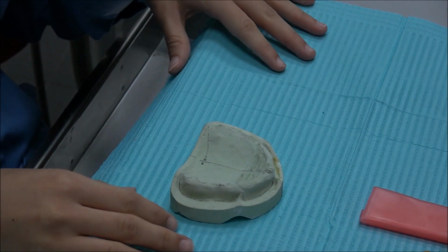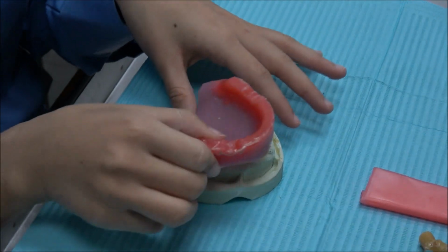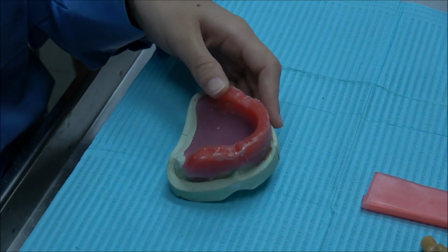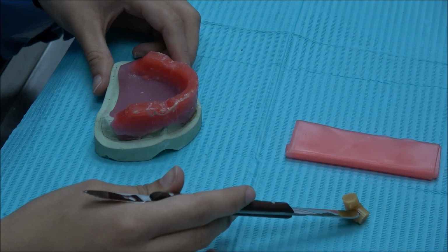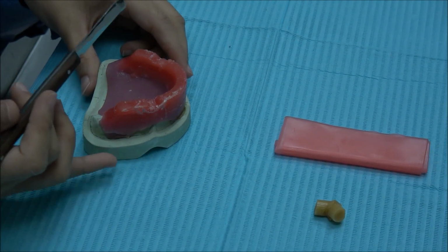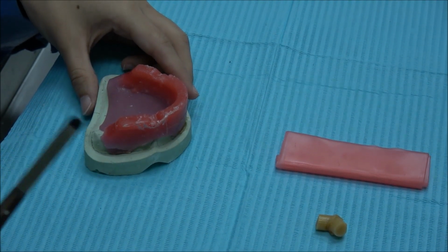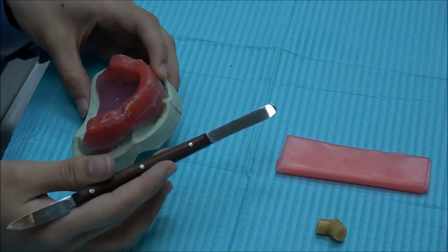Okay, next we are going to seal our bite rim to our models. So there are 2 techniques here. You can use either modelling wax or sticky wax. If you are using the sticky wax, make sure you soak your model first under the water for a few minutes. We prefer using the modelling wax, without soaking.